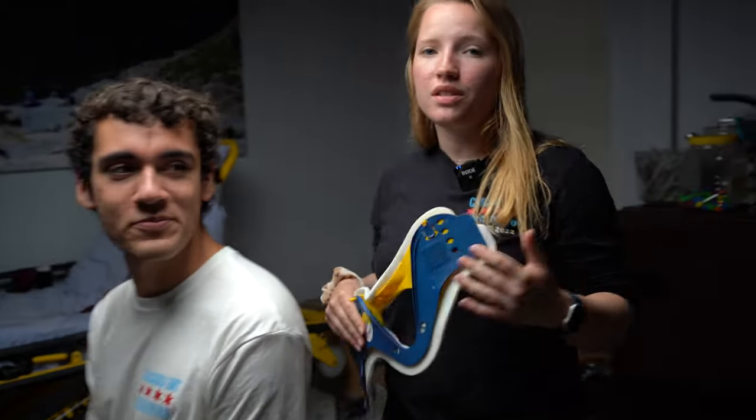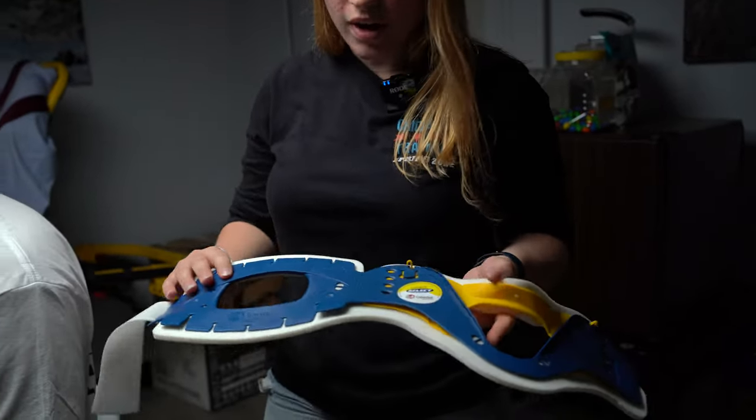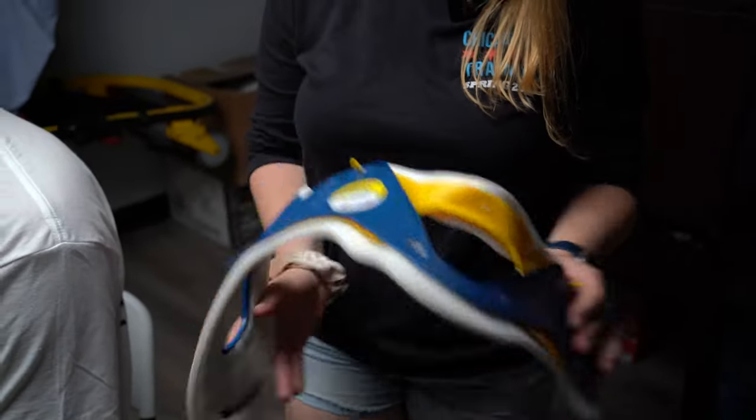Hey guys, it's Kimberly. We're gonna do the C-collar demonstration. Got Diego here to be my patient. So anytime we use a C-collar, we want to make sure we measure up. Let's walk through the C-collar. We have the collar here — you've got some velcro to secure it all the way around, but we want to measure it up.